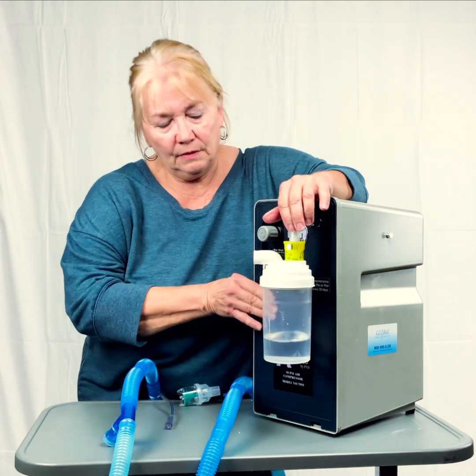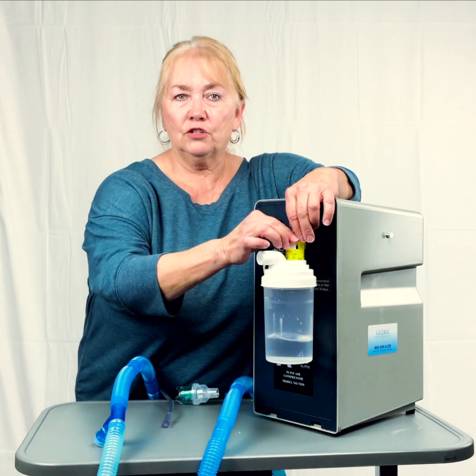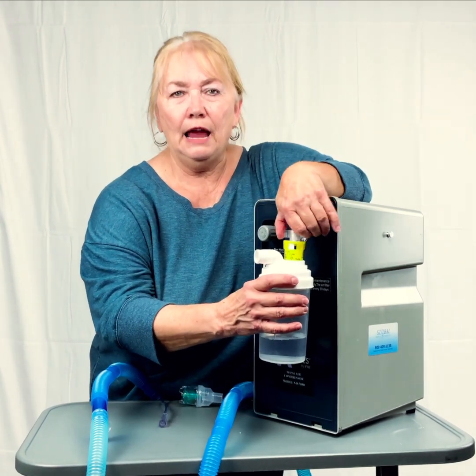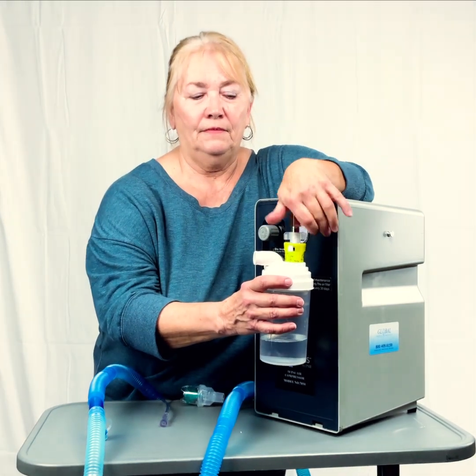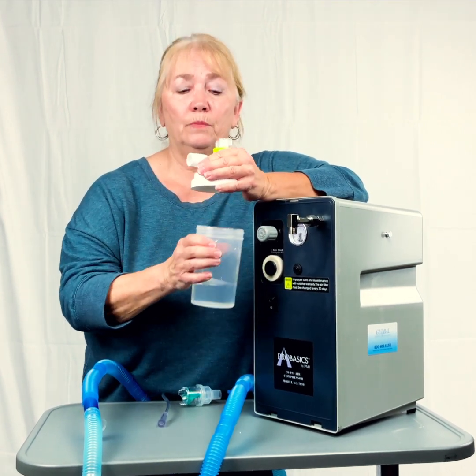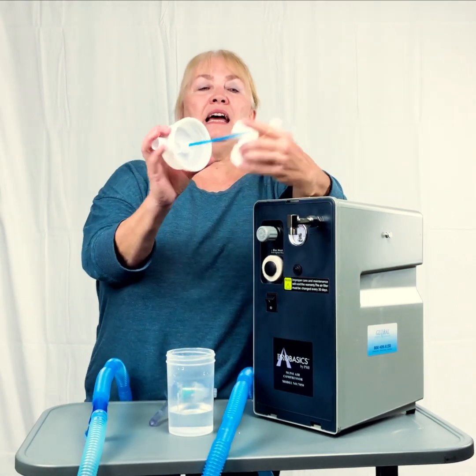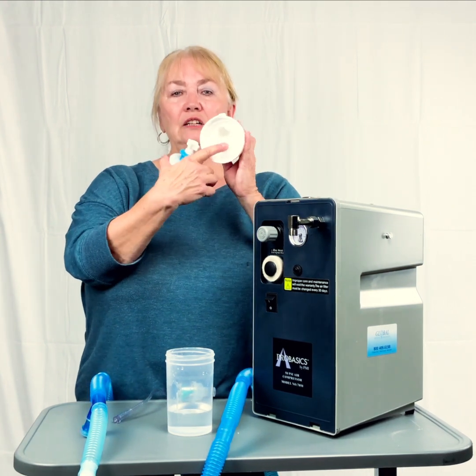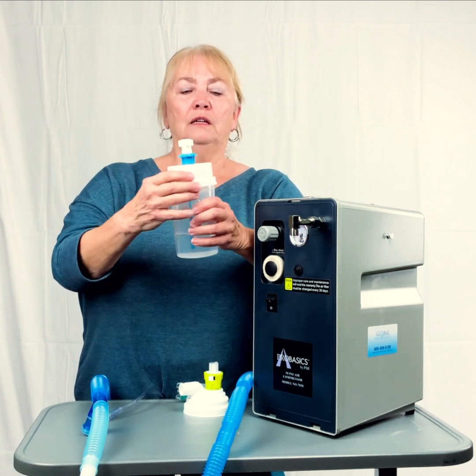Now, I have no mist. My bottle's screwed together, screwed on good here, it's screwed on there. Everything is good, except I'm missing a piece. And I will show you. Again, this is a nebulizer bottle, not a humidifier bottle. It does not bubble, but it doesn't have the straw. This one, the straws come out. So it has to have the little straw to force the air down into the water bottle to make the mist.